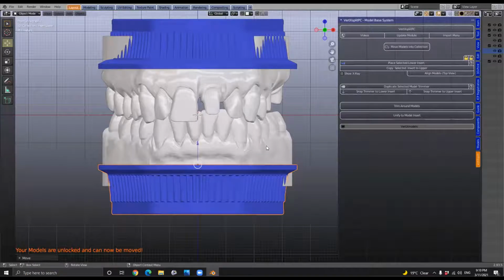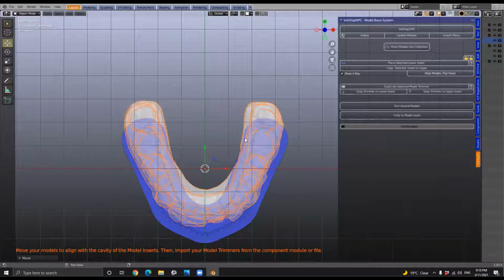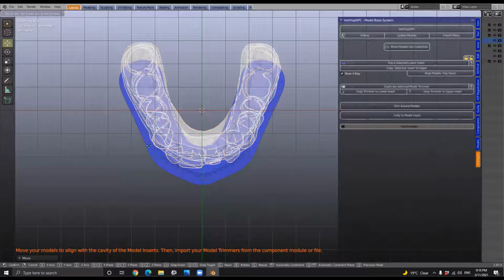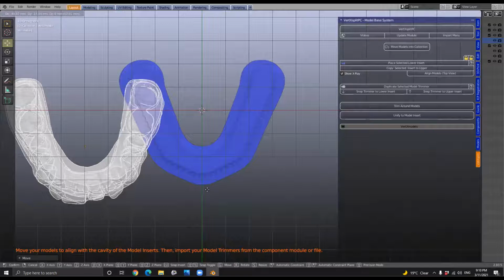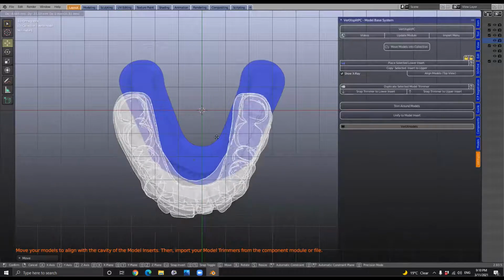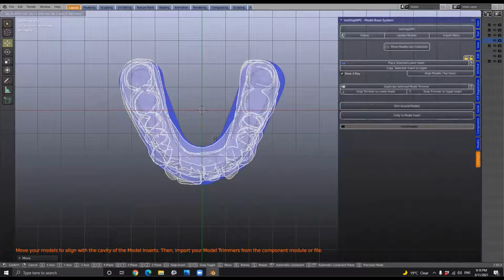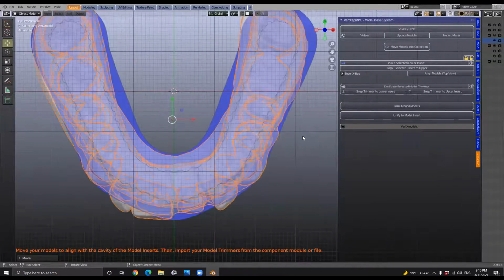So we're looking at it from the front, we're setting them, and then the next step is we're going to align the models into this. So we're going to align that. And this gives us a lower view from the top. It's very similar to the study models. So we are in transparent mode. If I use the G key, I can move this around, and my objective is to get this in this cavity. I'm looking at this cavity in transparent, and I'm trying to align it so that the teeth are over this cavity, which we can see like this. It's more or less aligned where we want it.